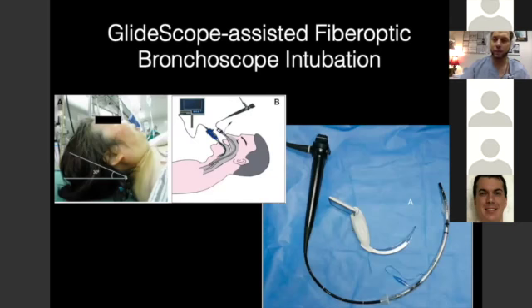If someone goes to give some Versed, they don't push in a bunch of high concentration remifentanil. It's not going to get me into trouble. Or if someone closed the IV and I didn't realize it, it's not going to all collect in the tubing. And then all of a sudden I have an apneic patient with a tracheal tumor. So I will get the remifentanil going at 0.05 mics per kilo per minute. And then I'll go up by 0.025 mics per kilo per minute every couple of minutes until I see a couple things.